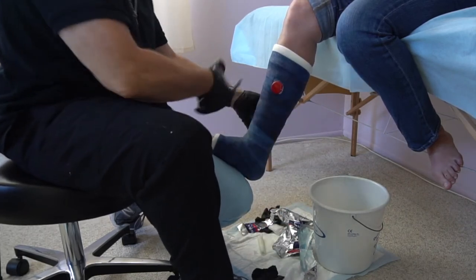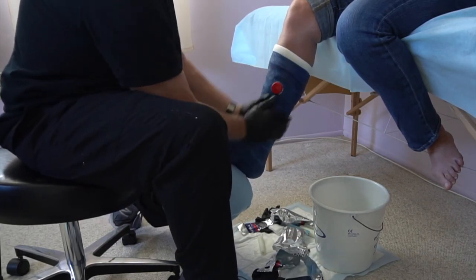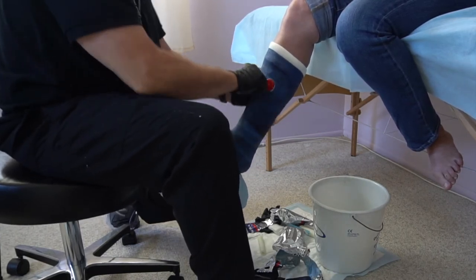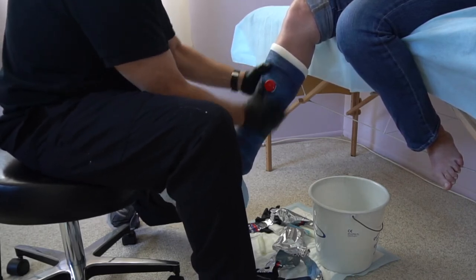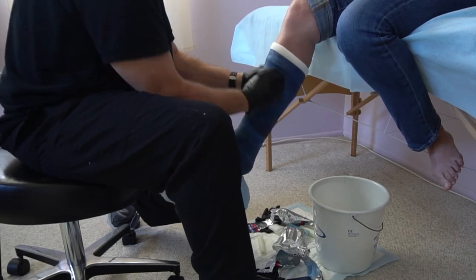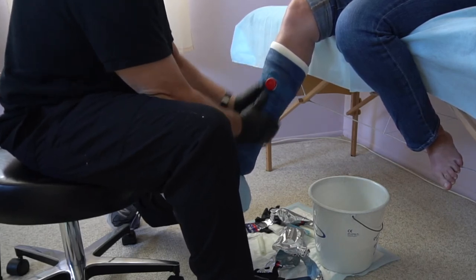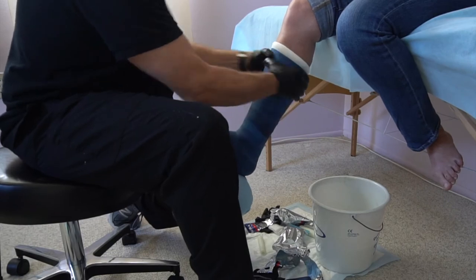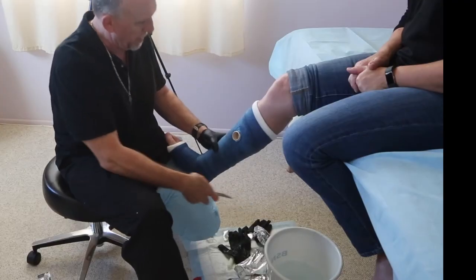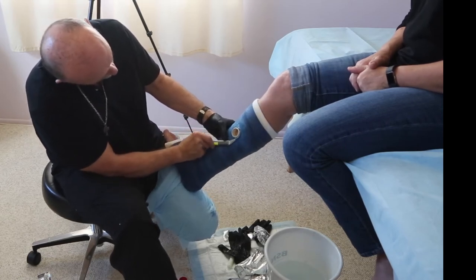Either work your way down with it to reinforce it if you've got plenty, or just cut that free and flatten it. And if you can see, we did bring the fiberglass up the side a little bit — I'm not worried about that. We'll take the red cap off and get rid of that in just a moment. To trim this out and put the good cap on, we're going to get rid of the red one that's covered with fiberglass, and with the little pointy scissors we can easily get right down to the base of this and get rid of this excess fiberglass.